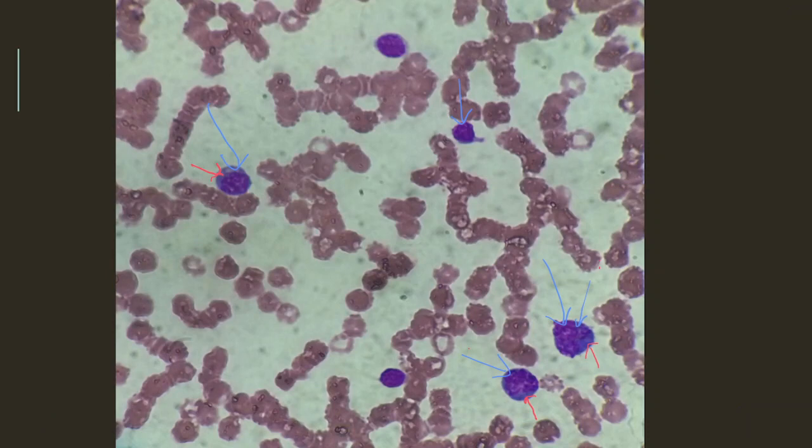So these larger lymphocytes with a little more open chromatin and irregular deeply basophilic cytoplasm — they are reactive lymphocytes. Whenever we find reactive lymphocytes, they are suggestive of viral infection. And in this smear, we are not seeing many platelets at all, so we have to rule out viral infection, and especially Dengue fever because of the low platelet count.